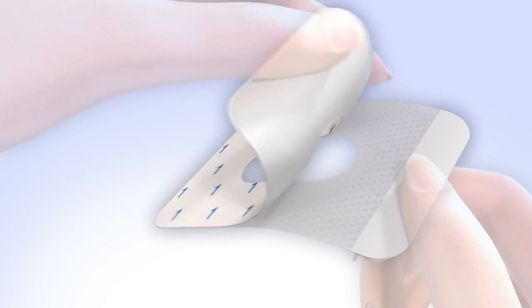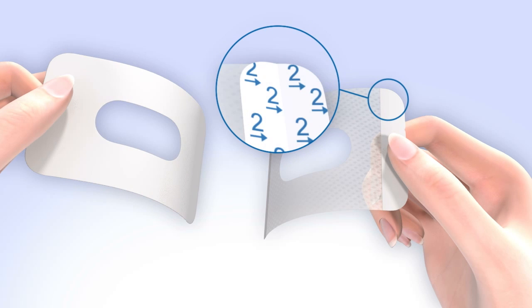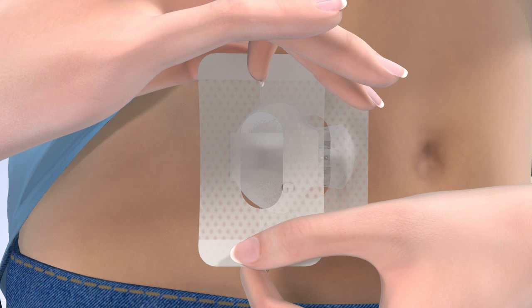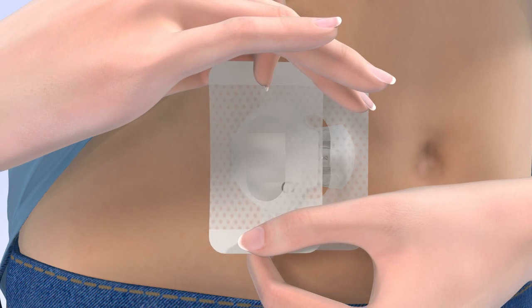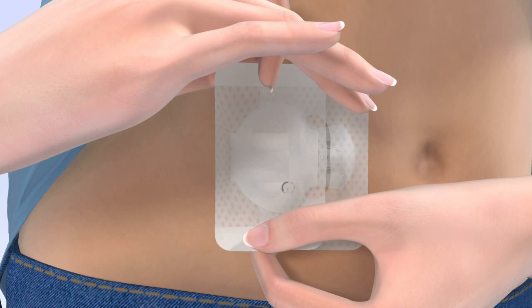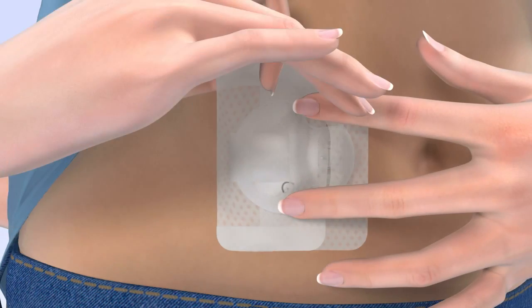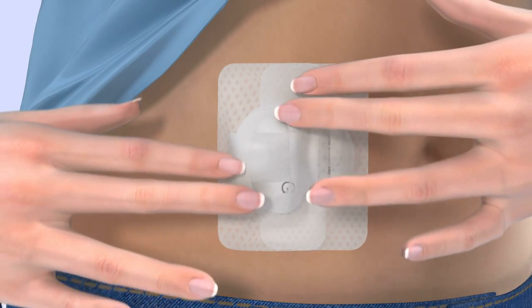To apply the tape as shown in Option 2, remove the paper backing marked by the number 1. Do not remove the number 2 paper backings just yet. Hold the overtape by the covered ends and position it the same way as the first piece of tape. Apply one side of the overtape so it covers the connection between the sensor and the transmitter, and apply the other side so it covers both the back of the transmitter and your skin. Option 2 covers the back of the transmitter to help reduce the chances of it catching on your clothing. Smooth down the tape on your skin and transmitter, then remove the paper backing marked number 2 and press the remaining overtape against your skin.